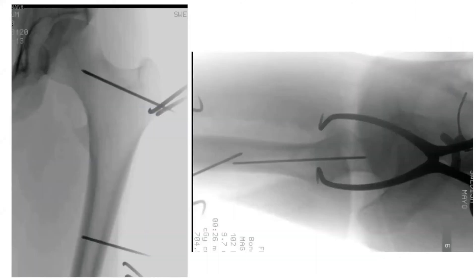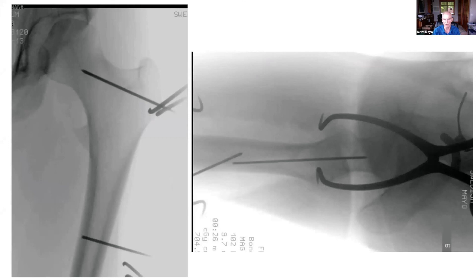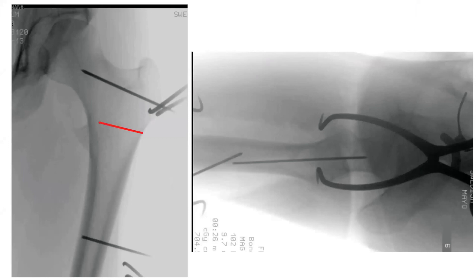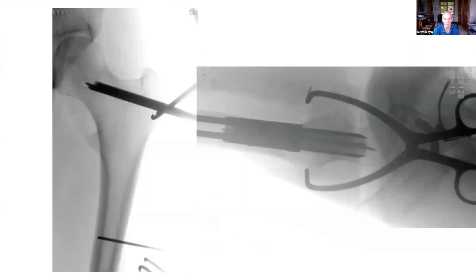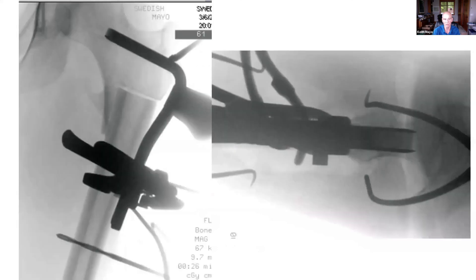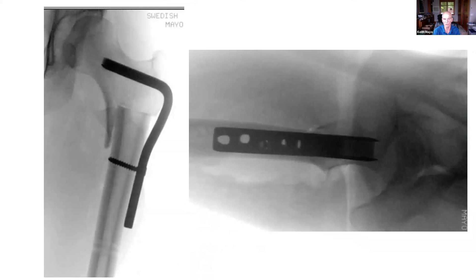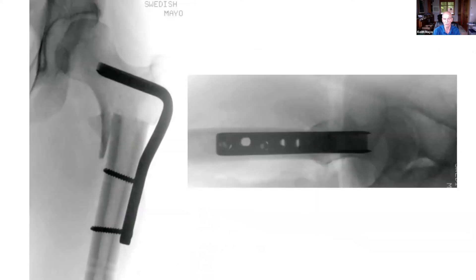We placed reference Kirschner wires, performed an incomplete intertrochanteric osteotomy and a complete subtrochanteric osteotomy, did a bony resection, and then shortened the limb by essentially translating the diaphysis up — having measured the relative widths of the diaphysis relative to the metaphysis to confirm it would work. The execution shows the seating chisel in place, then shortening, tensioning with one screw, and the final position.